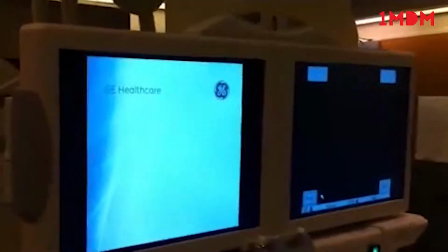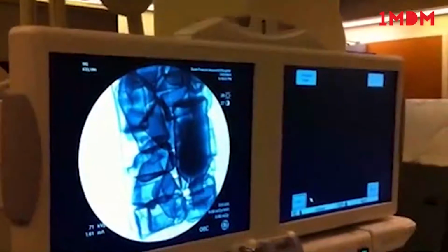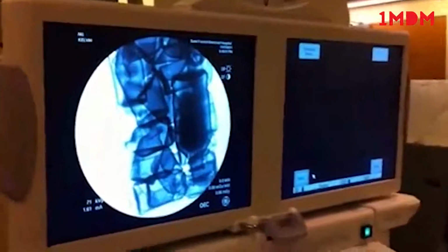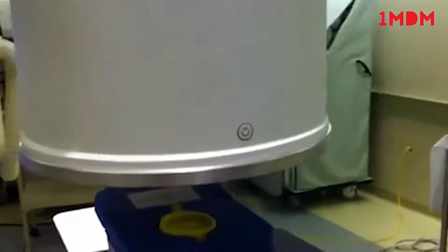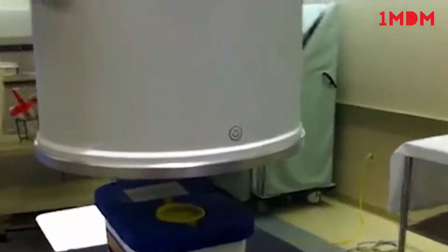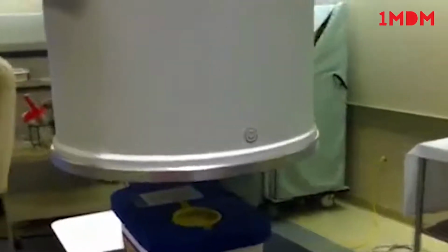Here we go. Let's watch the screen. You'll notice that the lights above are going to turn orange when the exposure is on. There we go. Look at all the insides of that patient. Notice that's not quite centered right, so let me correct it. Okay, now the picture is actually backwards. If you look over here, there's a little smiley face on top of the eye. This is supposed to be faced towards the head of the patient, hence the little smiley face.